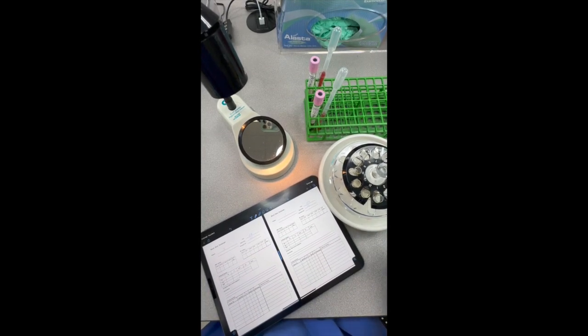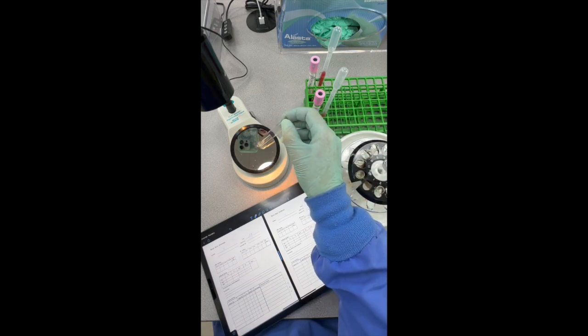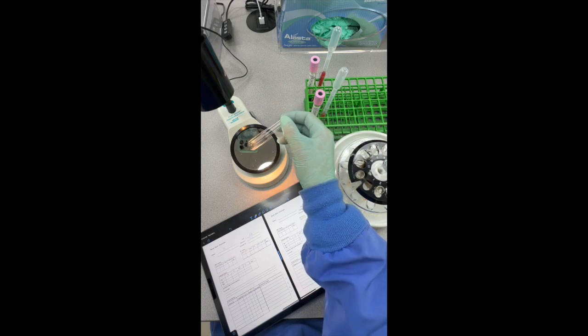Okay, we're back now to read. I have my specimens from the centrifuge. We're going to use our agglutination viewer here, and I have my sheets right here in front of me to record the results for both patients. So we're going to do patient H first. We're going to pull this out. We're going to use our agglutination viewer. And remember, this viewer is designed so that you look at the reflection in the mirror. That's magnifying. That helps you see the reaction so much better.